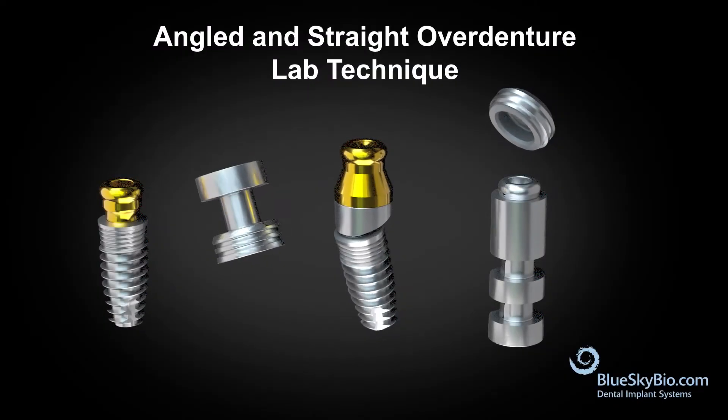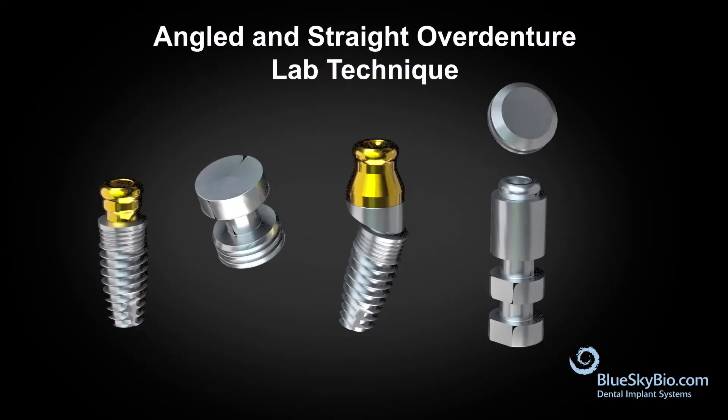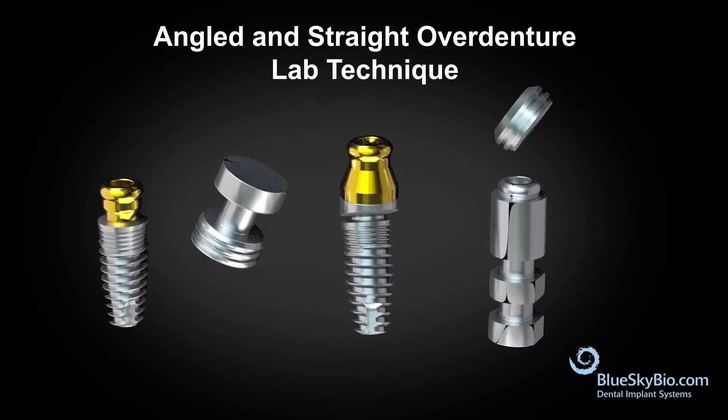This video shows how to perform an angled and straight over denture lab technique using the BlueSkyBio implant system.